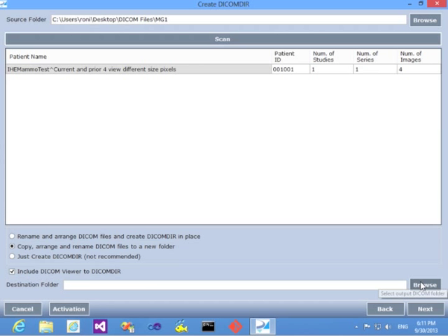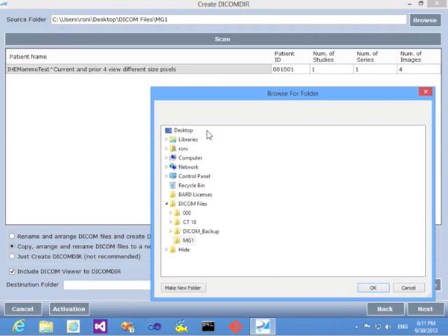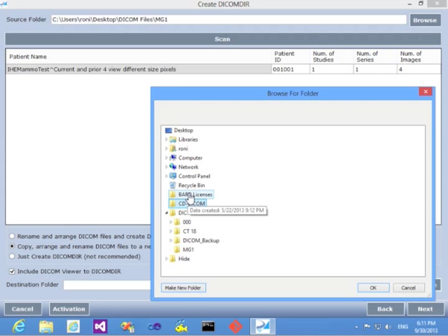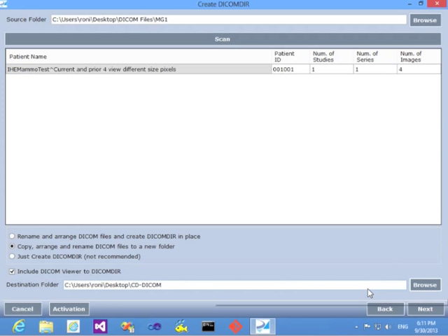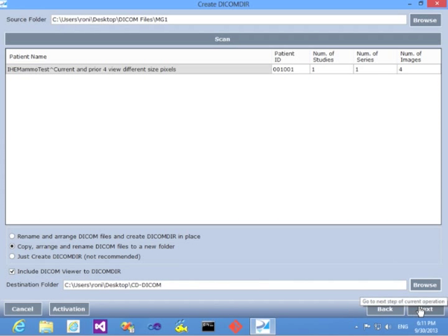Let's select the destination folder. We'll put it on the desktop, create a new folder, call it CD DICOM, let's say. OK. And select it. Then click Next.